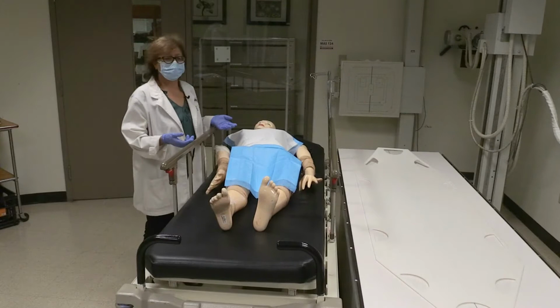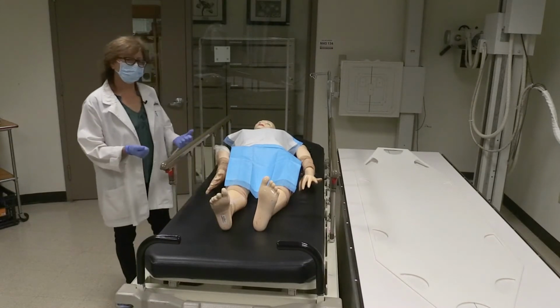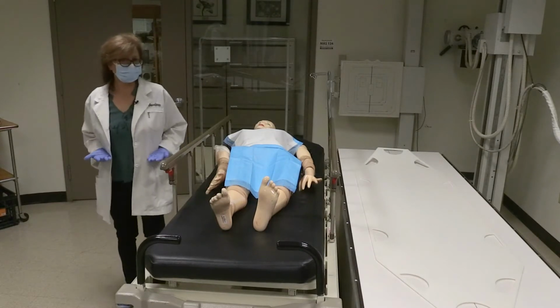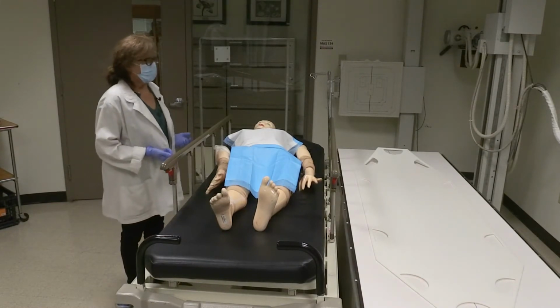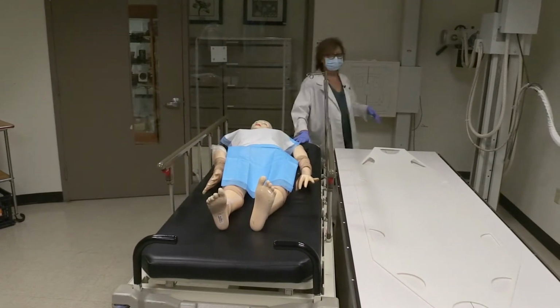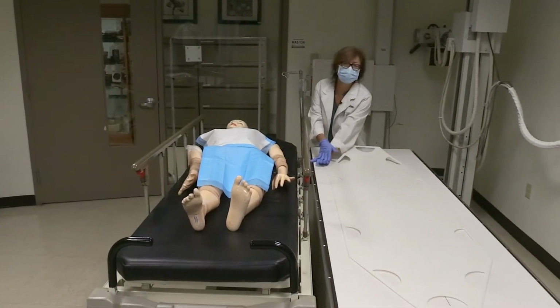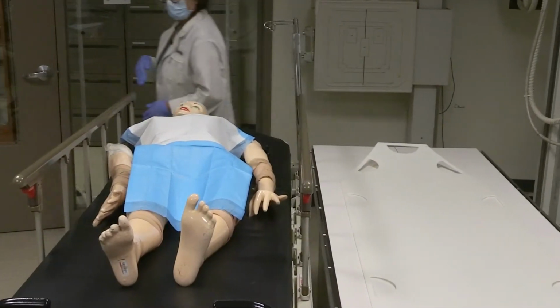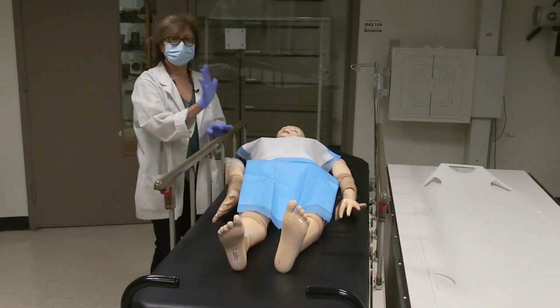When moving a patient, I want to make sure that I am moving a patient at the level of my center of gravity, which is about this area for me. I'm also going to make sure that this patient going from the stretcher to the table is slightly higher than the table. Because we want to go downhill, we do not want to go uphill.